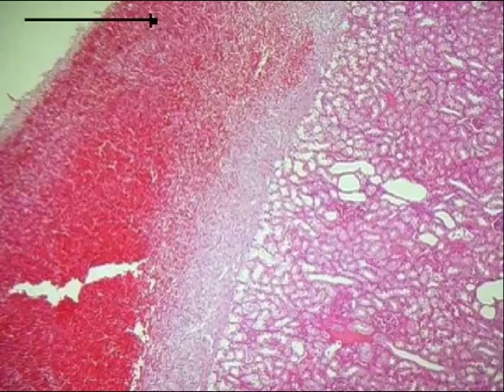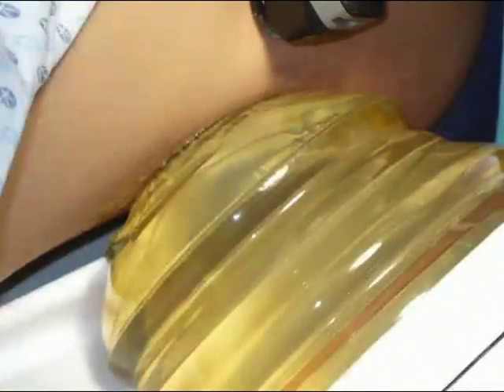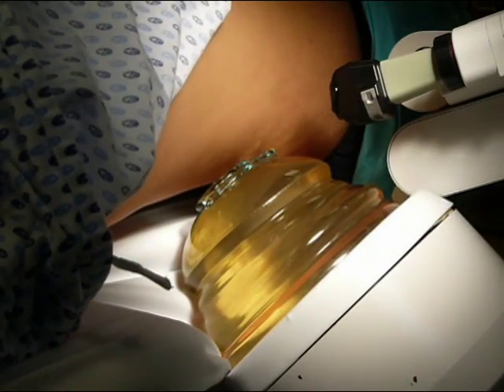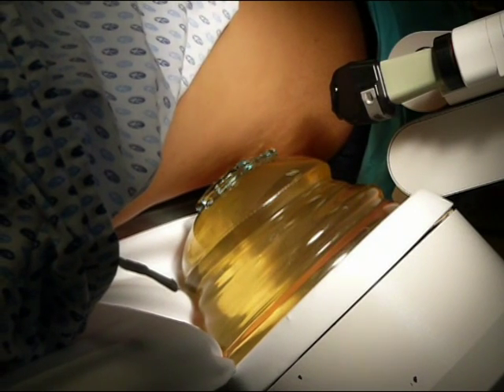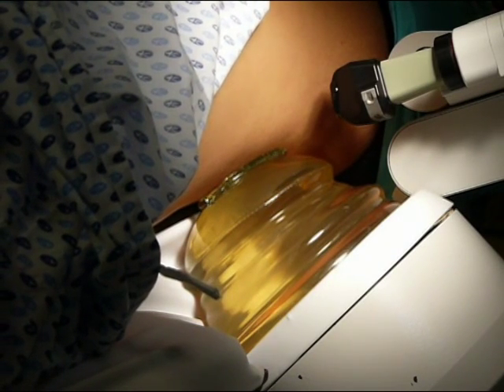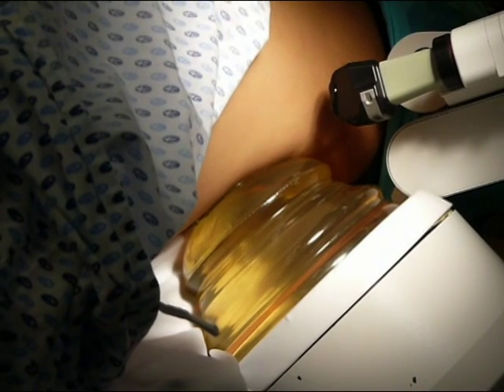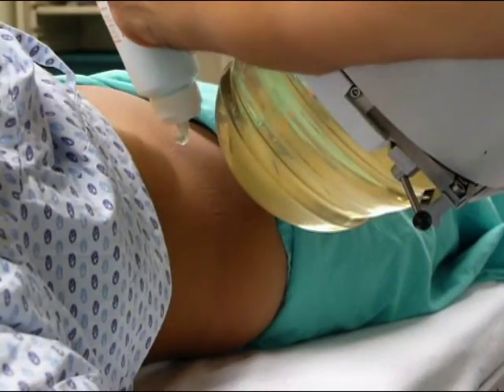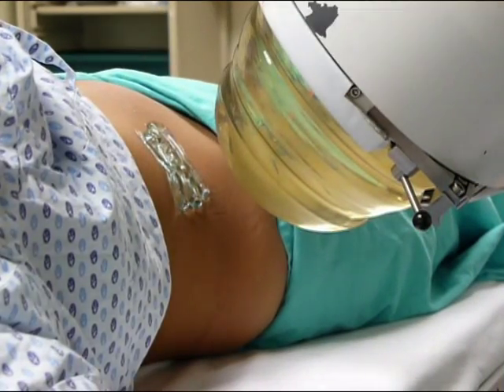Sometimes patients are being overtreated because of bad shock wave coupling. Plenty of acoustic gel should be applied on the membrane, because a thin layer of air does not allow shock wave passage. Patient movement during treatment may spoil good shock wave coupling. Special care has to be taken when using lithotriptors with two shock wave sources, since coupling may be inadequate on one membrane. Topical petroleum jelly is recommended, because the viscosity of the jelly prevents formation of cavitation bubbles on the skin, reducing pain.